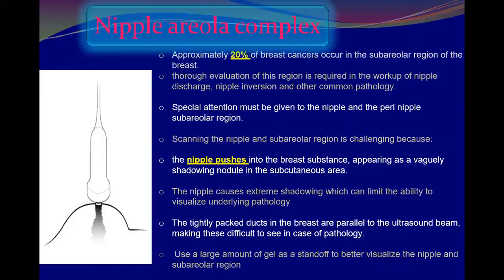You know that breast cancer in the subareolar region is about 20%. Evaluation of this area is required in the workup of nipple discharge, nipple inversion, and other common pathology, and to exclude breast cancer. So special attention must be given to the nipple and nipple areolar complex.